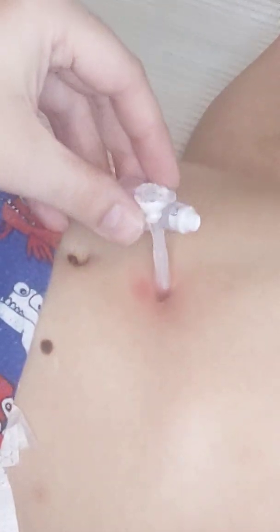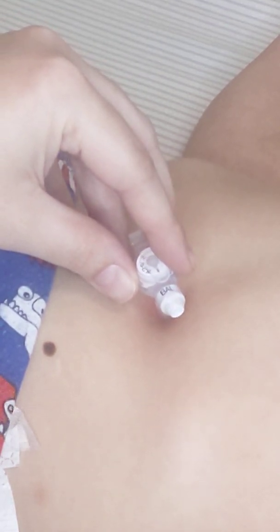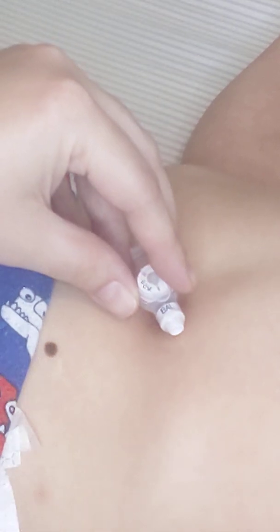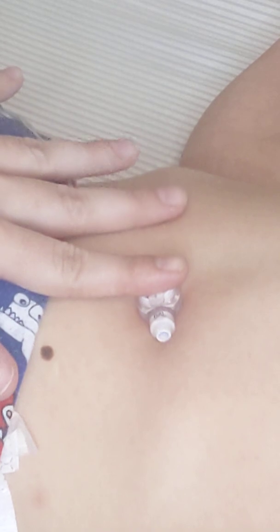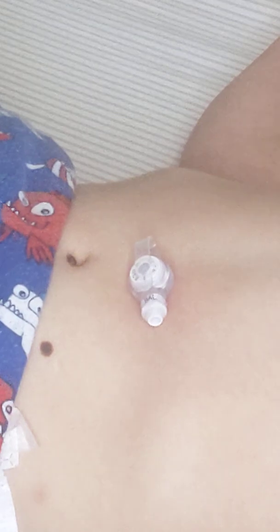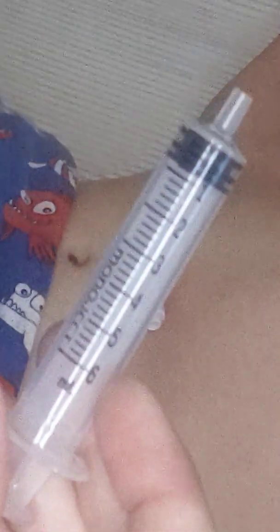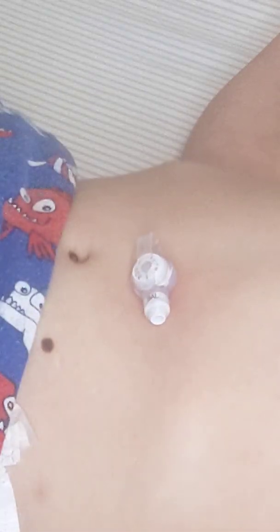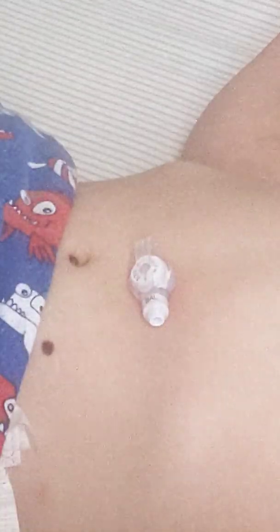It's just fine. So now you're going to take your button, put it into the hole, and slowly push it in. You can see he's not moving at all, no discomfort, nothing. It's totally normal. And then it's in. While that's there, I leave that there. I grab the other 6 ml syringe. Now, when I do this, I go ahead and put 6 ml back into the balloon.